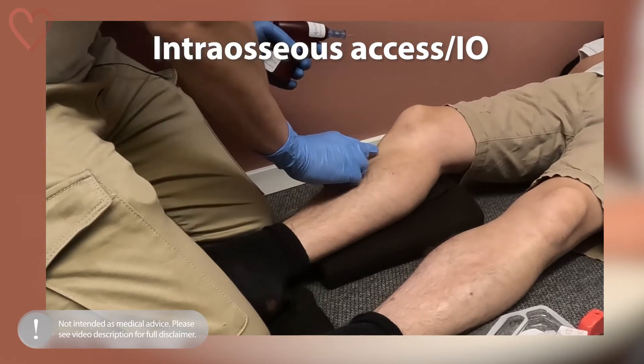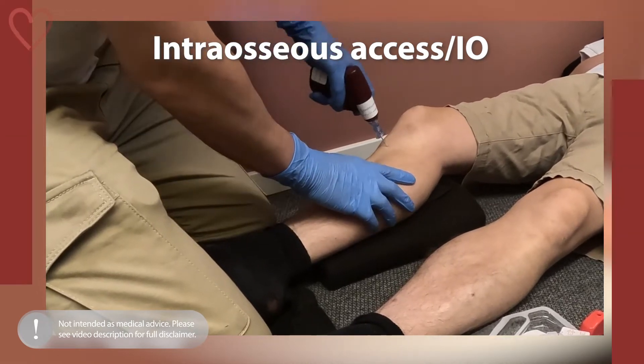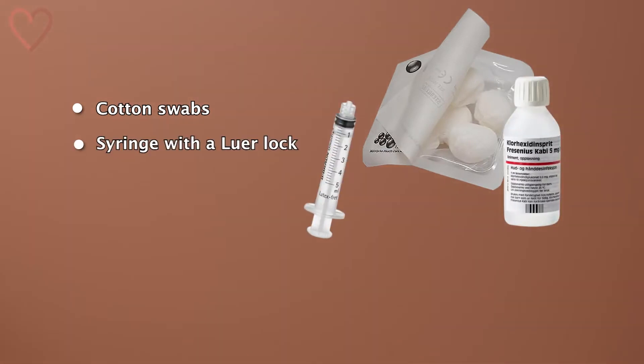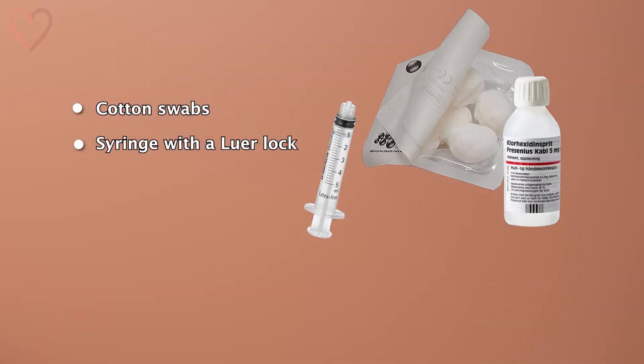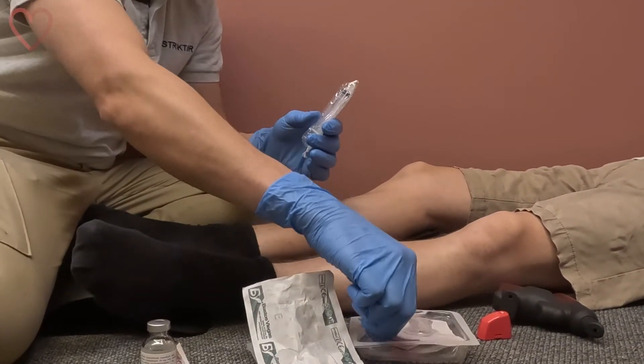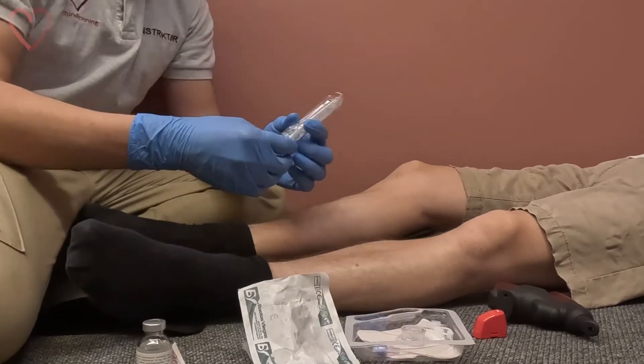In this video you'll see a live demonstration on an actual human. You'll need cotton swabs with a disinfecting agent and a syringe with luer lock, which allows secure attachment to the tubing since you'll be using relatively high pressure when flushing. Your tubing is filled with saline or lidocaine as per your local protocol.